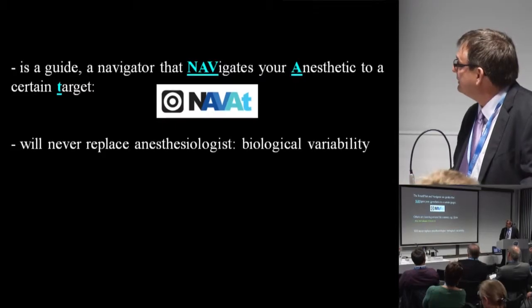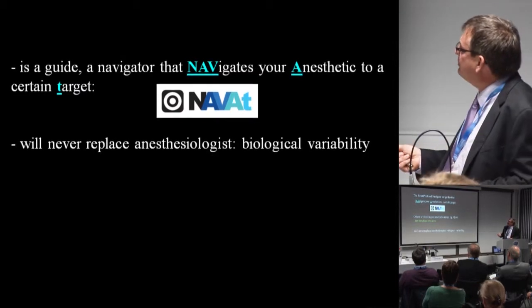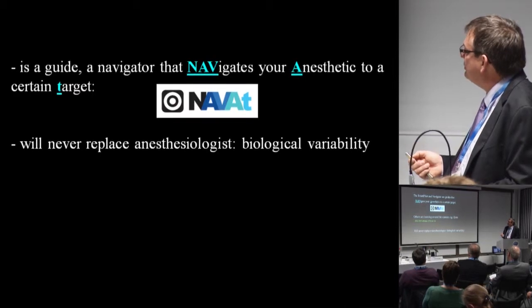So I hope this meeting will help bring these three things together: technology, research, and the relevance for clinical practice. So here we come to the name of the meeting. The smart pilot and the navigator are guides that navigate your anesthetic to a certain target. There are others that are looming around the corner. For example, the QCOM was presented at the last ESA meeting. It will never replace the anesthesiologist because there is always biological variability.